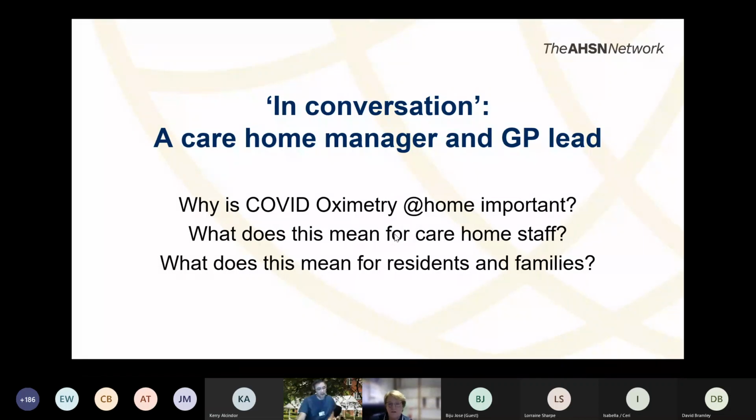Did you want to just describe how we started to do that? I think initially, the key information that yourself as a clinician required from us over the telephone was to be able to communicate effectively and actually present the resident if you weren't on site. So it was key that we were using manual blood pressures, the pulse, describing the pulse to yourself, and also the oximetry readings were paramount, and that we were then referencing the NEWS score, which now is just mandatory throughout, so that any observations, oximetry is part of those readings that are documented and part of the vital signs.